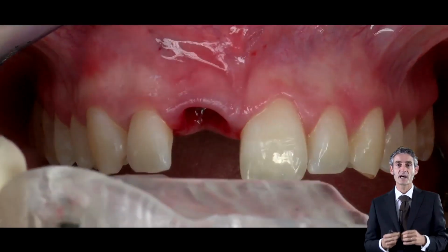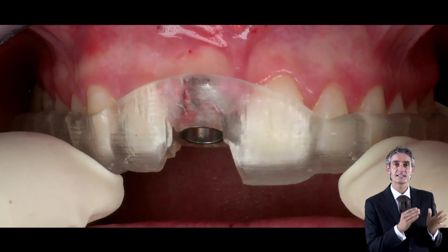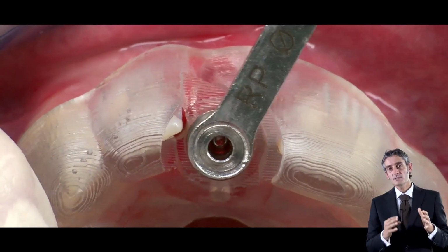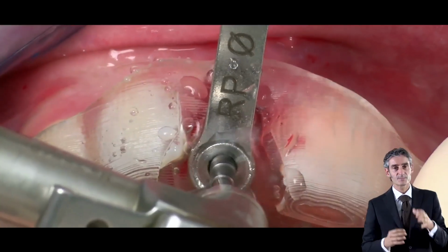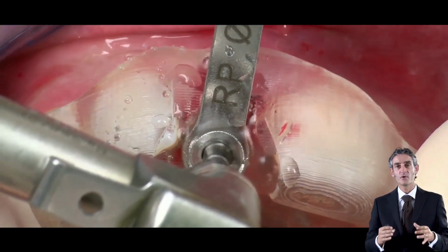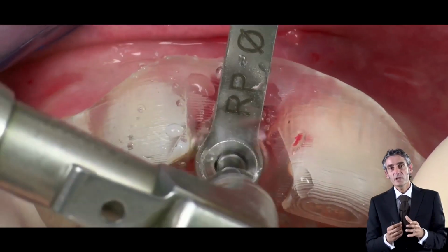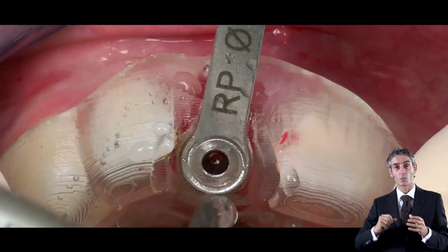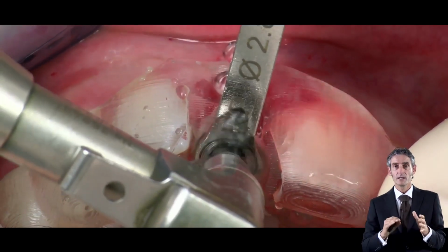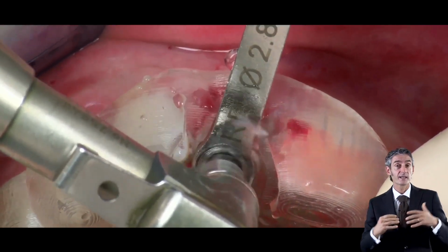So we place our guide in the mouth, and we start the osteotomy step by step. What is important to understand in these cases, especially if we are considering a prominent root, is to avoid underpreparing. What does it mean to avoid underpreparing? If we underprepare, the risk is that when you screw in the implant, this pressure can push out the shield and can create damage.